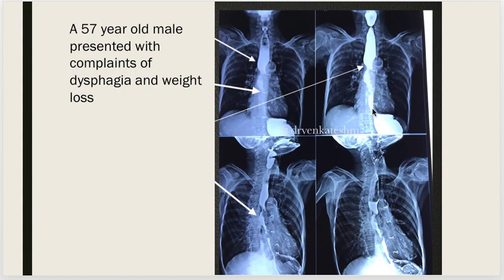The distal one third of the esophagus is normal in caliber, and contrast is freely entering into the stomach. This is the aortic knuckle causing a smooth impression on the upper esophagus. You can see the entire narrowing and mucosal irregularity.